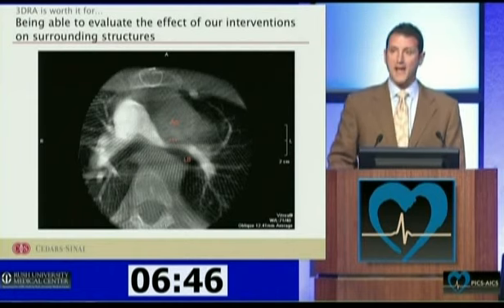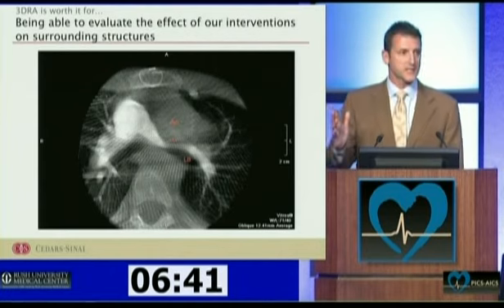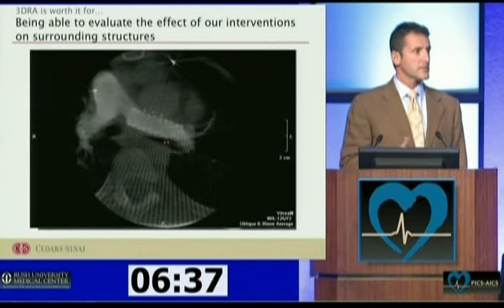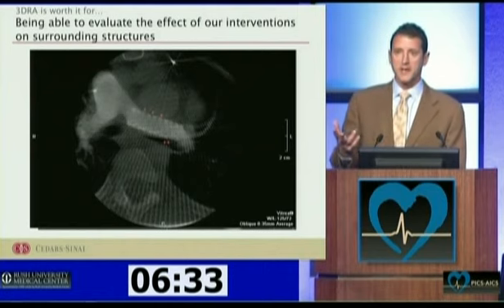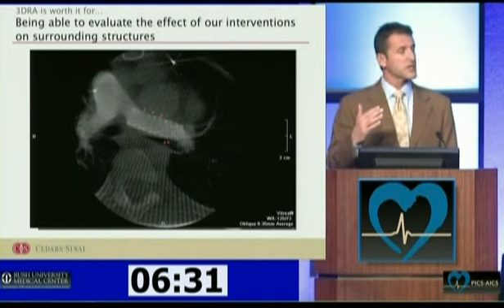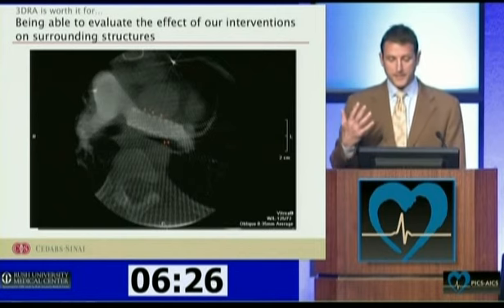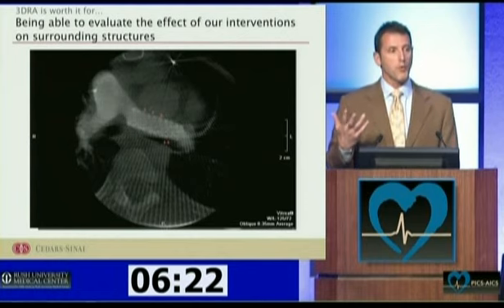posterior to it. And I can tell you, we had a lot of trepidation about this, but I don't want to just show you cases I backed out of. So we did go ahead and stent this, and we were really worried about this LPA being compressed, or what effect this would have on the aorta. Well, we ended up getting a nice angiographic result, but you can see a few things. The flattening of that aorta posteriorly. I don't know what effect that's going to have. It certainly makes me think a little more about erosion.